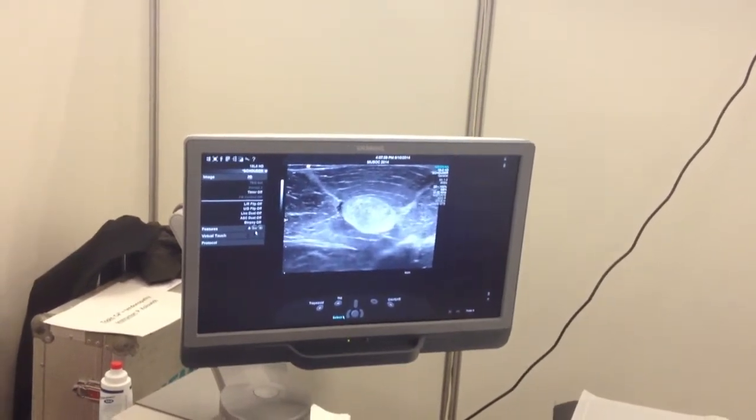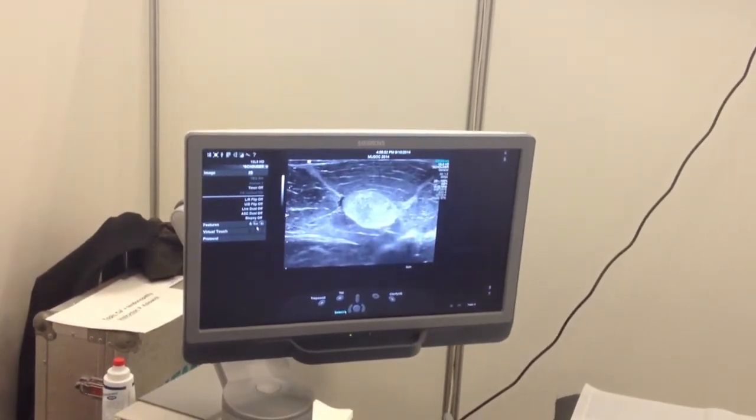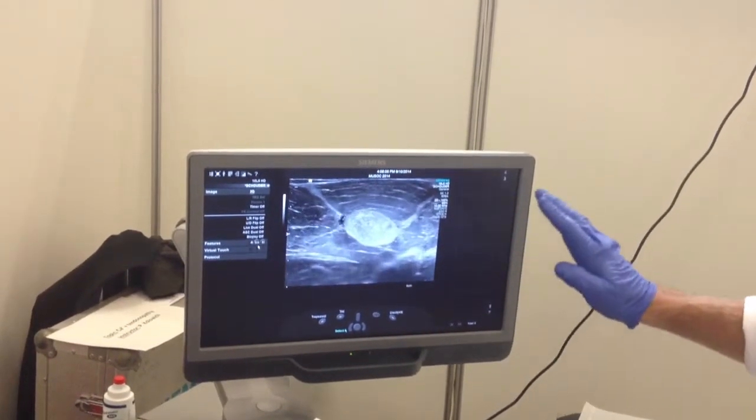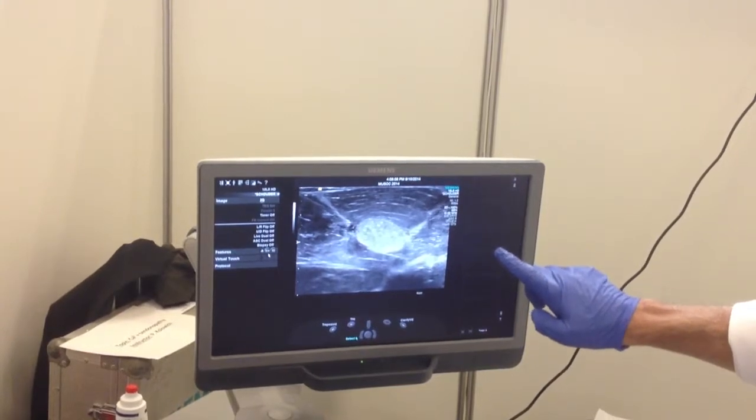When you're halfway, if you don't know where you are, just scan. Okay, there you are. Show me the needle better. Scan right to left. Okay, there you are. Alright, good.